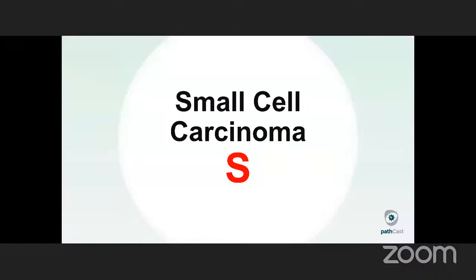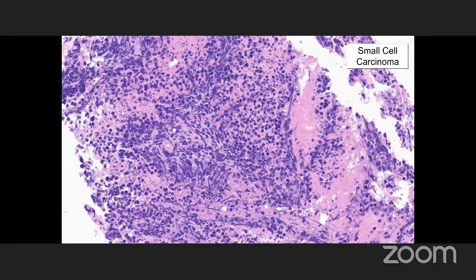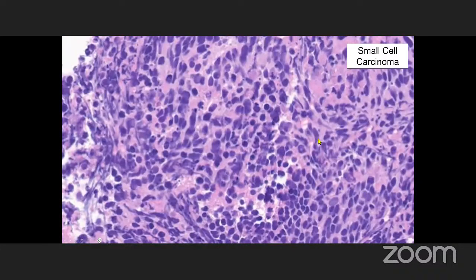All right, now small cell carcinoma. Just like we see in larynx, just like we see in lung, the features are very similar in the sinonasal tract. If you see sheets of ugly hyperchromatic cells, particularly if there's a lot of necrosis, again, these very hyperchromatic, kind of angulated cells where they're not really round, but they're also not perfectly spindled, they're just a little bit angulated. And then we look for nuclear molding. There's a little bit of nuclear molding here as well, apoptosis, mitosis.